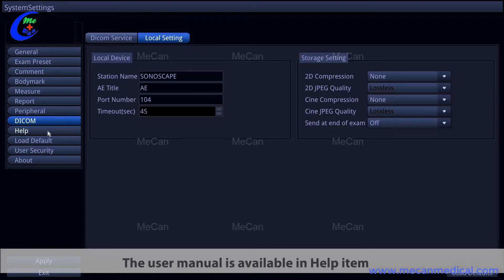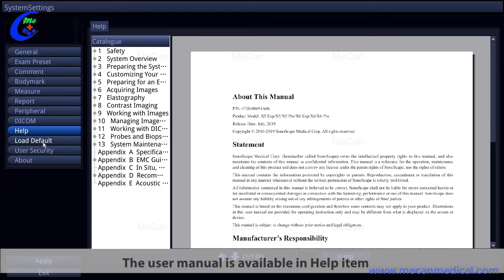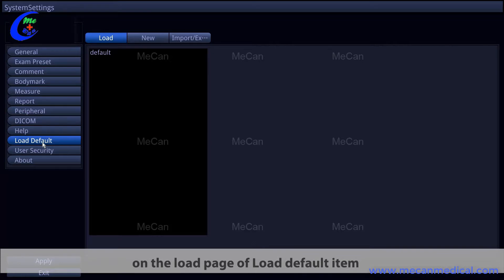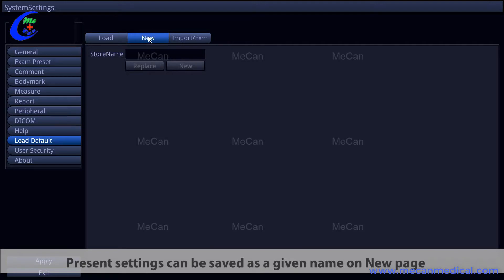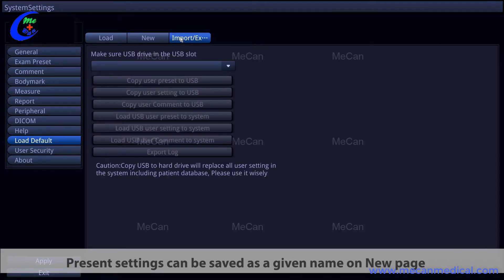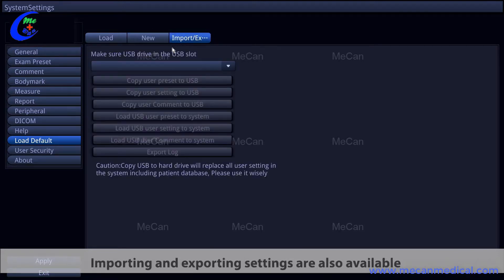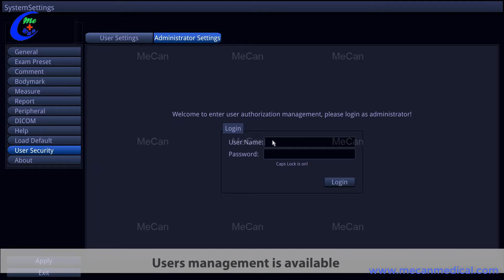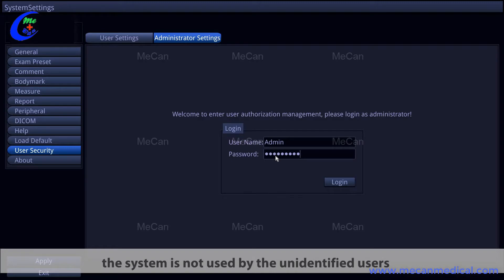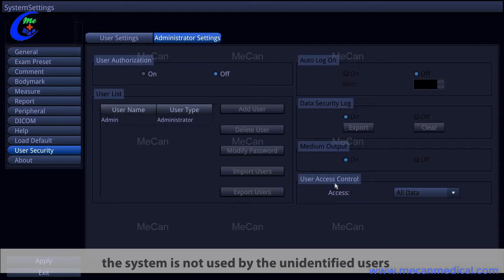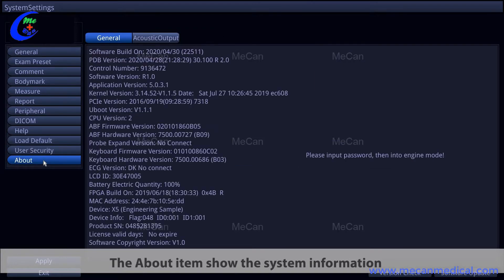The user manual is available in the help item. You can load default settings on the load page. Present settings can be saved under a given name on the new page. Import and export of settings are also available. User management is available in the user security item to ensure the system is not used by unidentified users. The about item shows system information, which is important for troubleshooting.